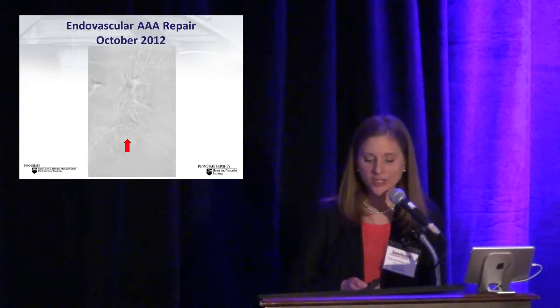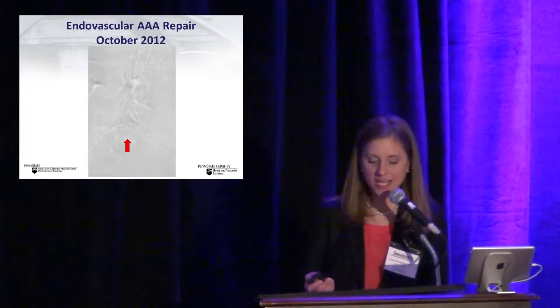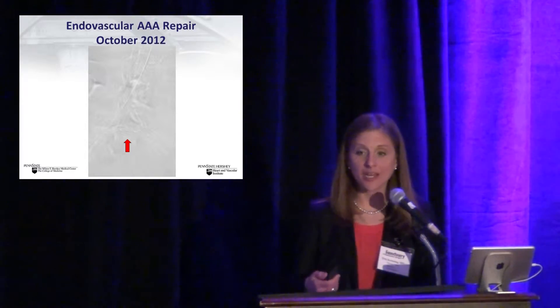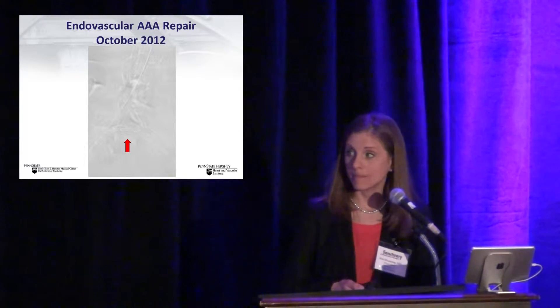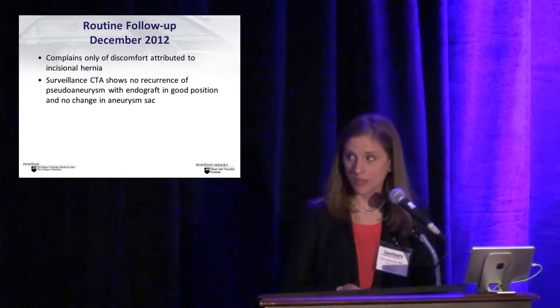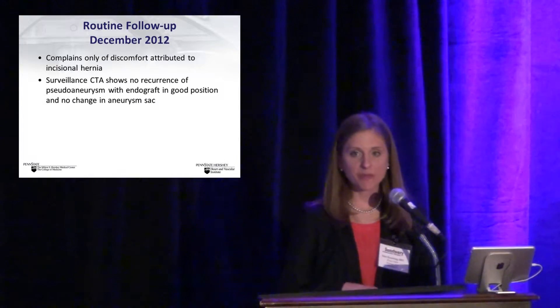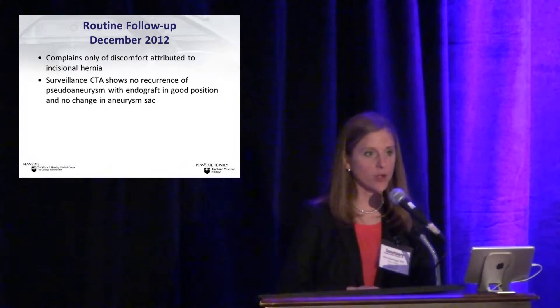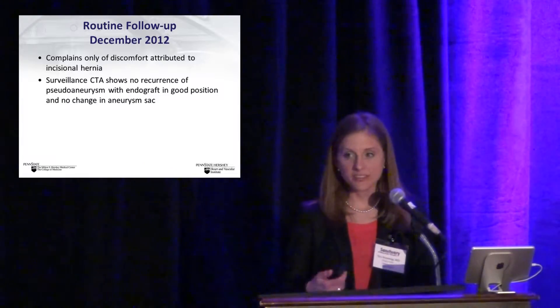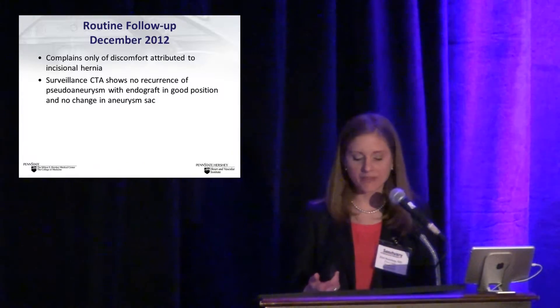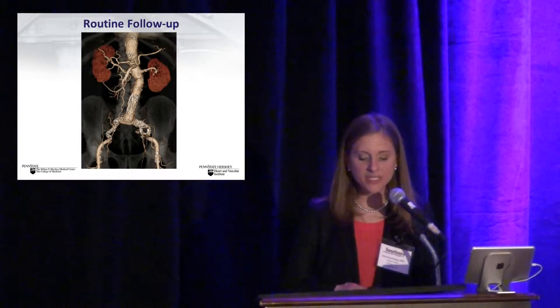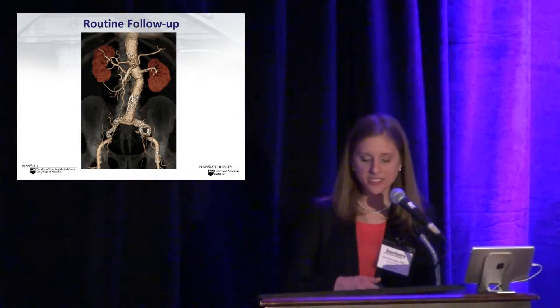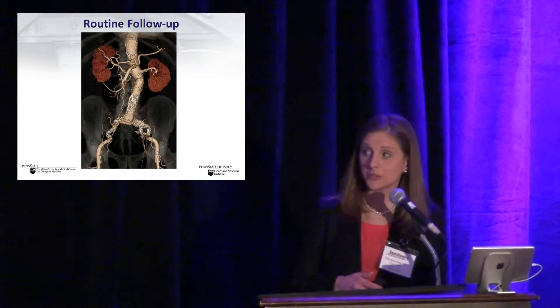Note that contrast extends outside of the stents, which is normally seen in this particular device where the fabric is not adherent to the stents except at the proximal and distal attachment points. In surveillance six weeks postoperatively, the patient only complained of his incisional hernia. Surveillance CT showed no recurrence of the distal aortic pseudoaneurysm with the endograft in good position.